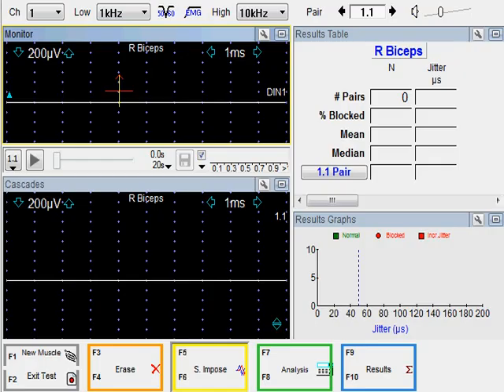I have now inserted the needle in the tested muscle. We'll ask for a slight contraction, adjusting the needle. We can also adjust the trigger level. And here we have a nice spike. Going to adjust the trigger level.